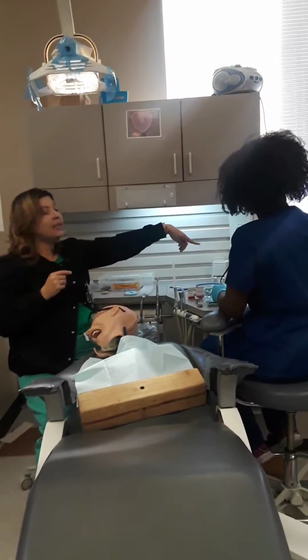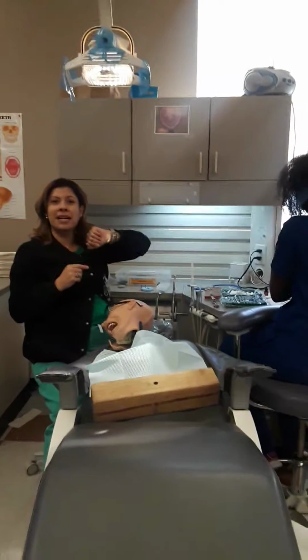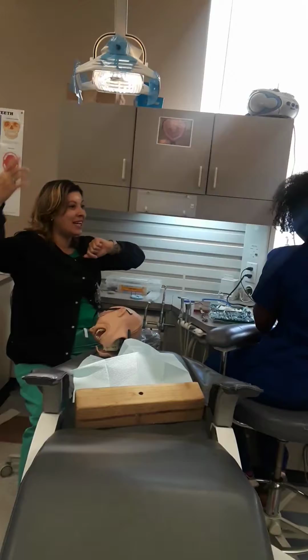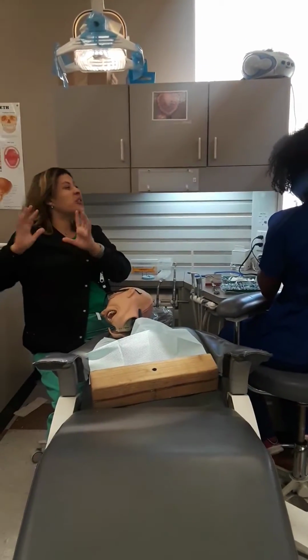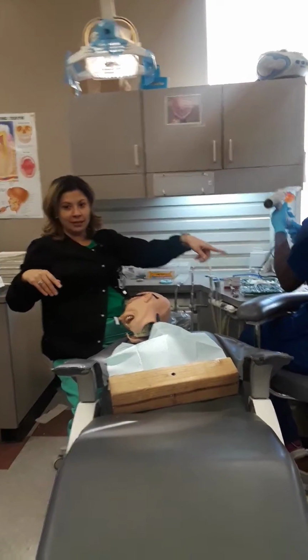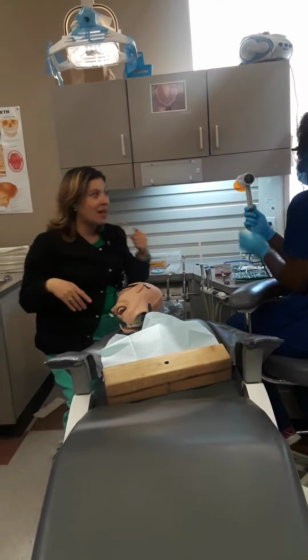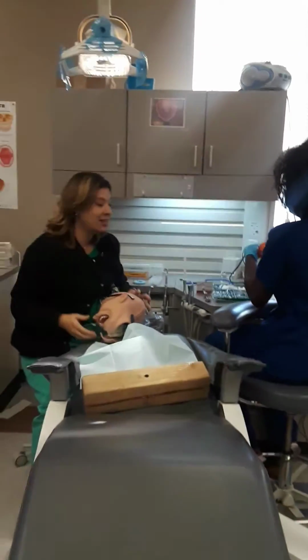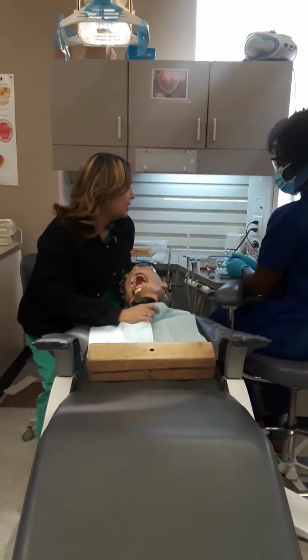Okay? Good morning. What else? Light curing unit. We got a very old one. I thought I saw a new one, but I think that belonged to Mrs. Meekins. It was green, sitting over there. It was like a wand, and it had a charger and base. Those are so new because you don't need the big machine. It looks like a blow dryer, right? But it's actually a curing light. They have wand ones, which is nice. It's cordless, so you don't have any cords to mess with. So there are different types.